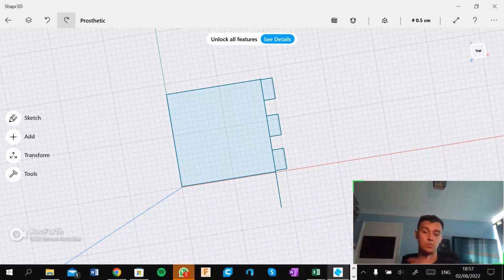And one thing I found that was a bit of an issue with Shaper 3D is the lines. If they're not perfectly straight, they will go off on a tangent and it will mess everything up. It's the hardest thing to rectify. And I only really found that out towards the end of it when I was trying to flip everything around or change everything up. It was a bit of a learning curve. And so in future I'm going to make sure everything's straight and everything's done.